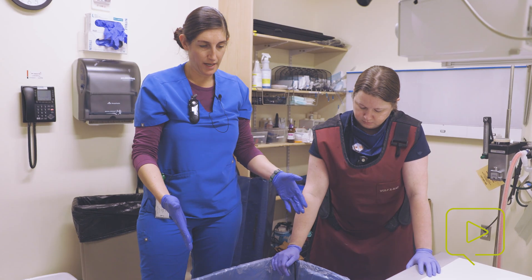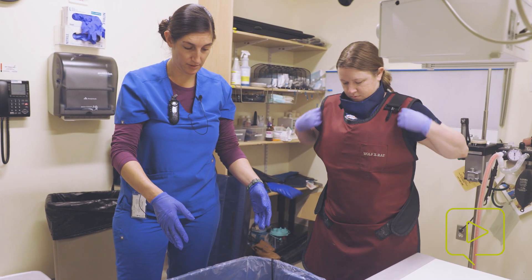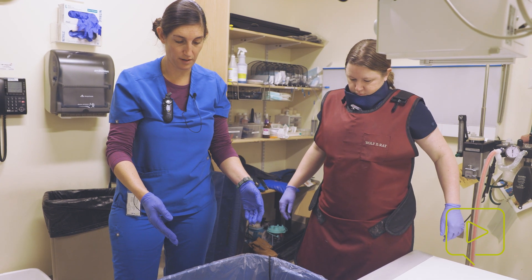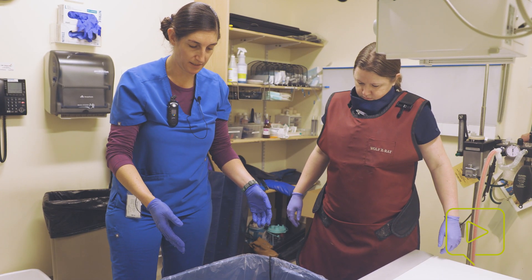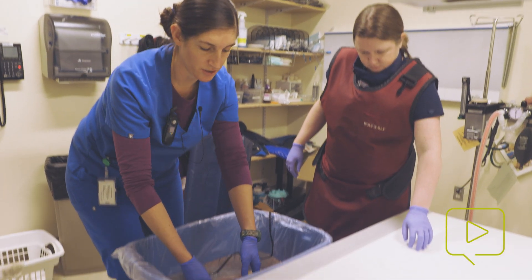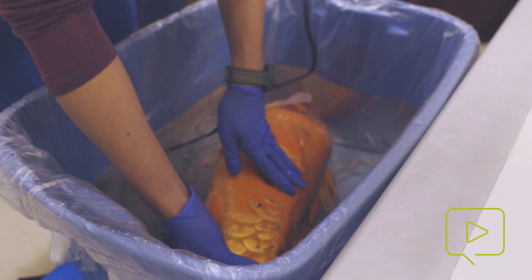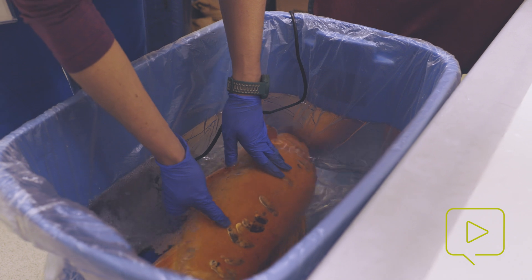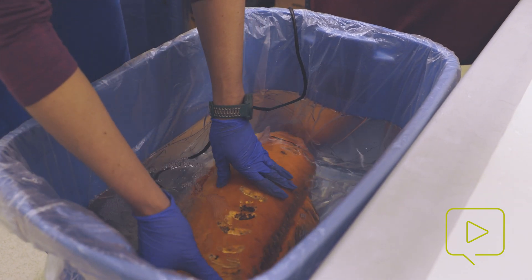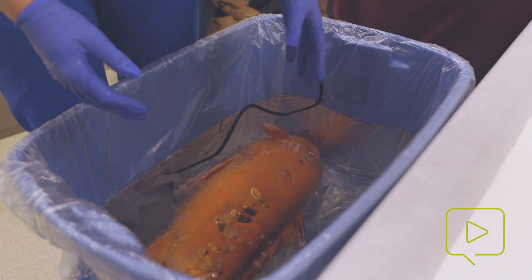So now we have Joanna here in the x-ray room because we're going to take x-rays. She's been in the tub for approximately seven minutes and is showing signs of being sedated. When I touch her, she's not moving her fins. She is still gilling on her own, which is important to monitor for respiration. She is slightly responsive but asleep enough that we should be able to take an x-ray film.